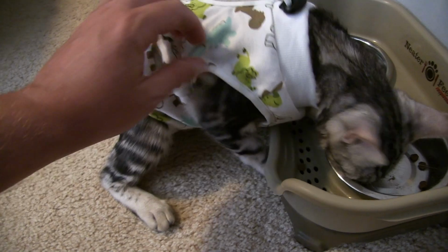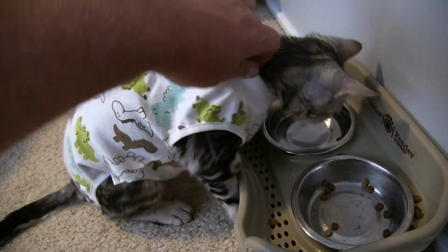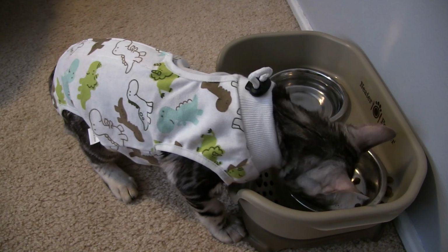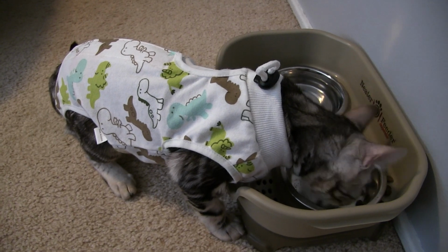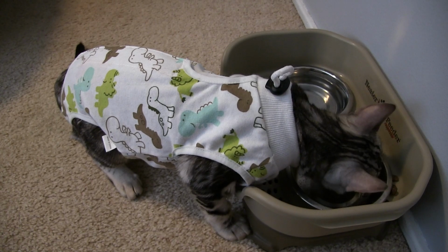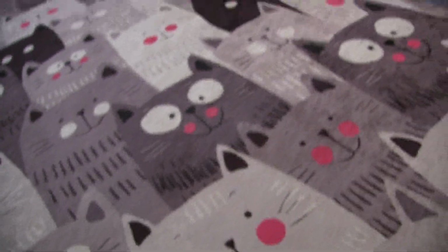Suit seems to fit well around the legs. There's a little pull strap. Let's just make sure it's not too tight. That's fine. The other cats are beating at the door because they heard me fill this food bowl, and I think they're hungry too, and they want to come in here and get some food. They're scratching at the door. And then here in the back, I'm sure everybody wants a close-up of a cat's butt, but it seems like there's enough room there for her to do her business. It's not covering up the privates, so when she has to go to the box, she's like, who dat?